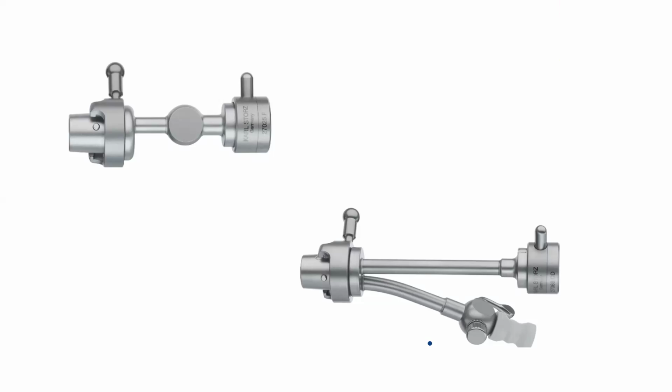These equipments were important when the field of vision of the telescope was very narrow. To turn the telescope towards the orifice, especially with a large median lobe, would be very difficult. But today, with the expanded view of the telescope, these equipments have become redundant. Okay, sir.